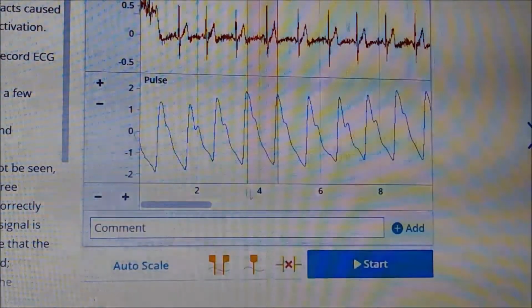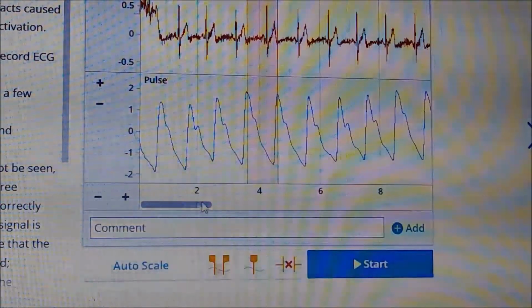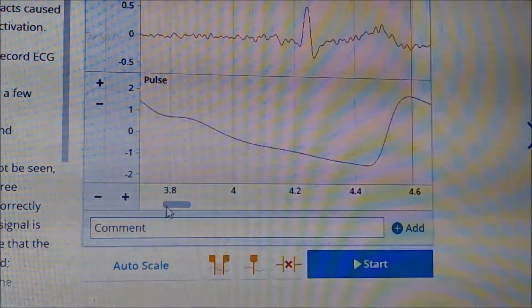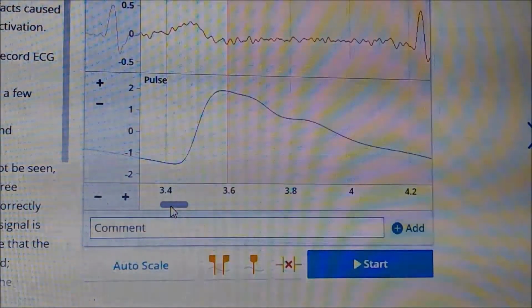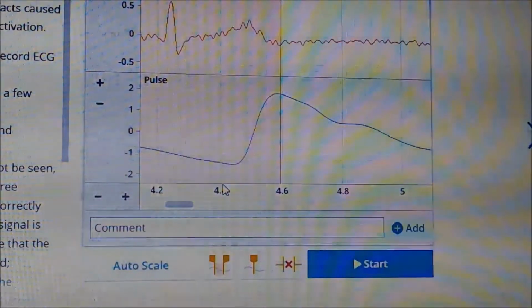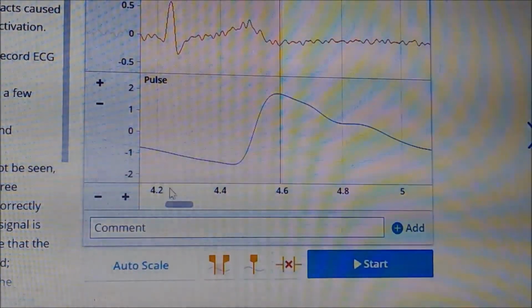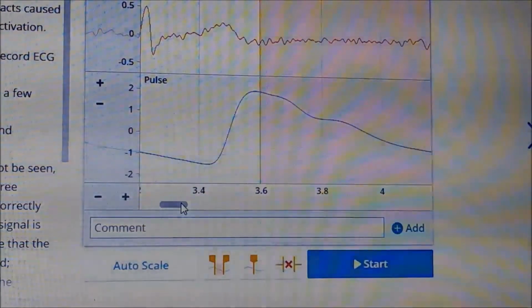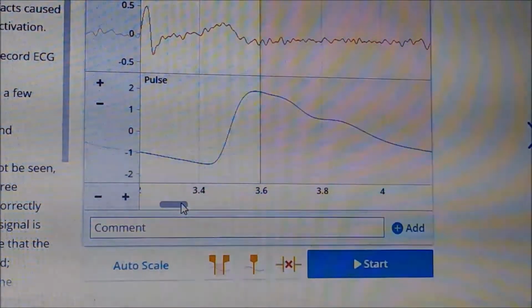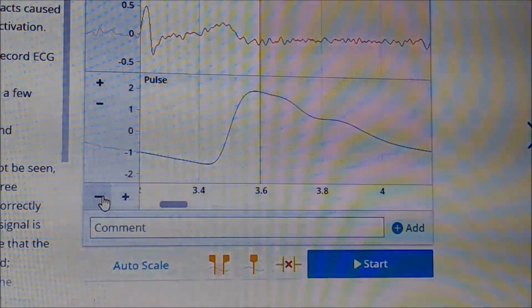Next, we want to scroll down and look at the time signatures at the bottom. You might need to zoom in using this plus or minus tool. So we're going to zoom in right here and scroll over so we can see the starting time as well as the ending time duration between those beats. So we have an ending time of 4.6, and in a second we'll scroll back and see the starting time, which was 3.6, and from there we can calculate the final time minus the initial time. So 4.6 minus 3.6 gives us 1 second duration for that beat.